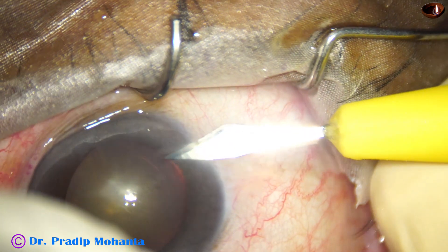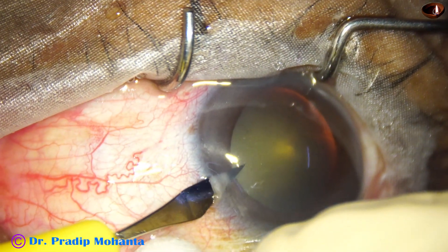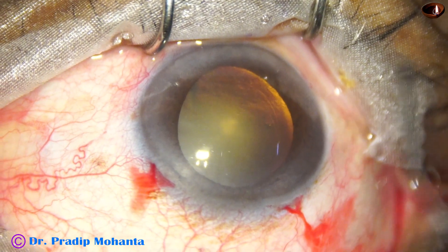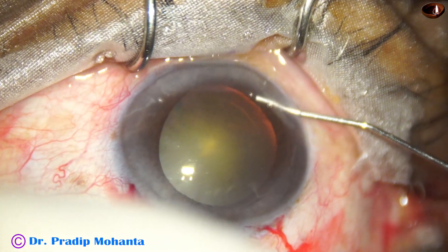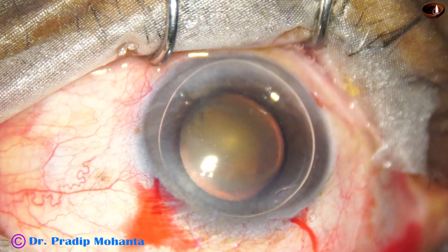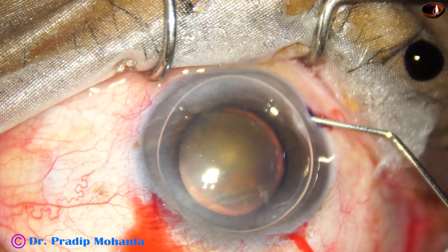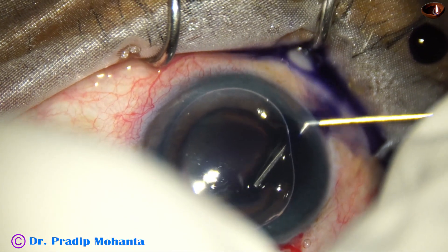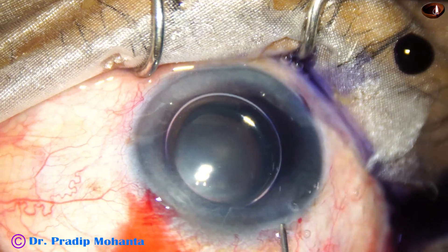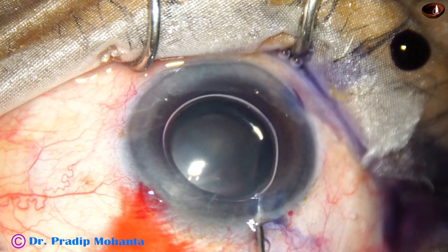The main incision has been made. This is a side port on the right side of the main incision and a small side port on the left side. There is some overlapping of conjunctiva on the cornea superiorly. Now we are going to stain the anterior capsule with trypan blue dye underneath this air bubble — here goes the dye. If we use an air bubble, the dye is not diluted by aqueous and staining becomes fast.